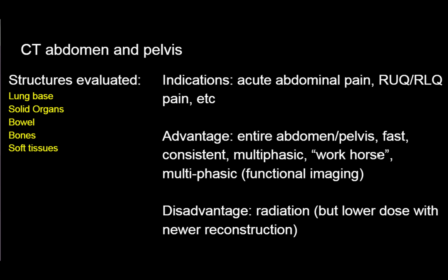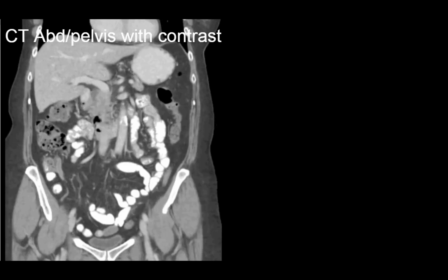The advantage is that it's very fast, consistent. Typically, it's independent of institutions and scanners. And we typically get very high quality images, and it's not operator dependent like ultrasound. The disadvantage, of course, is radiation. But now there's new reconstruction algorithm that reduces the radiation exposure to patients compared to before.